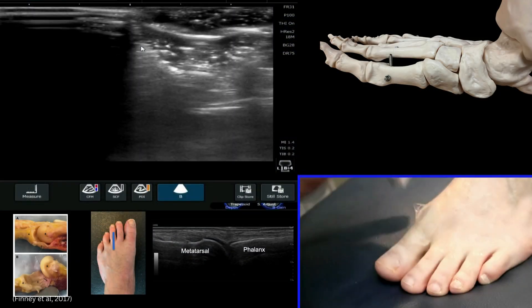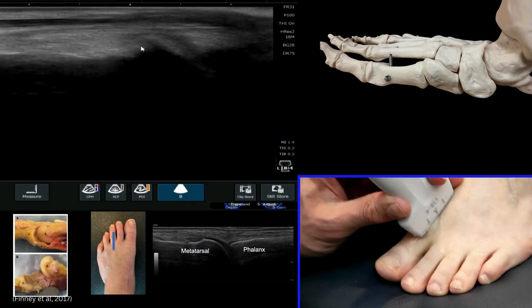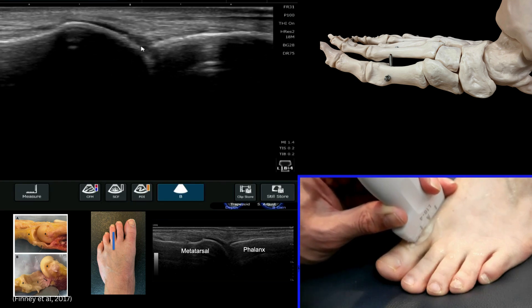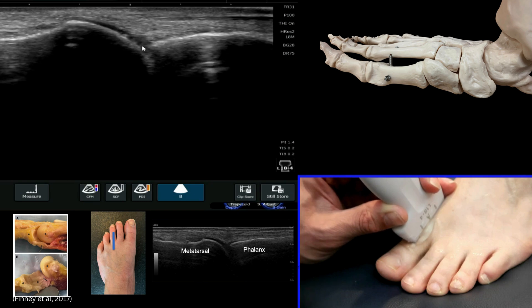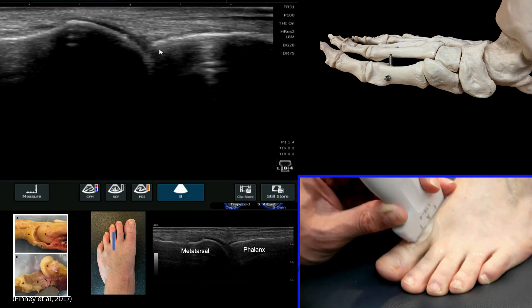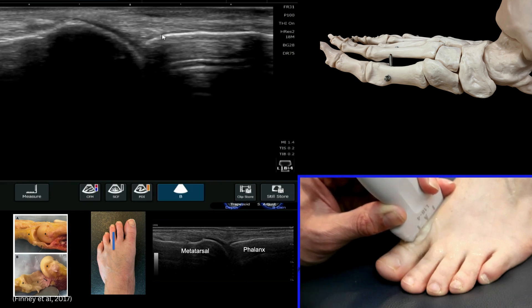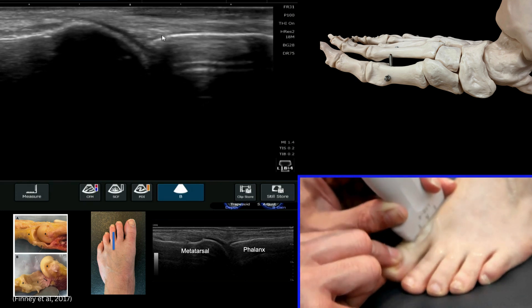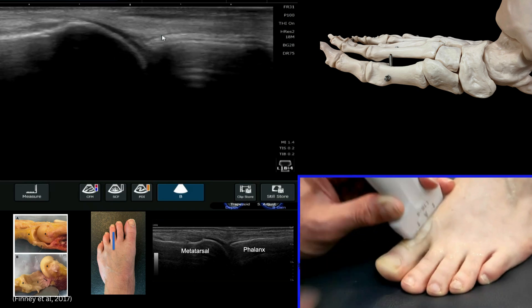We're now going to have a look at the dorsal recess of the metatarsophalangeal joints. If we look at the first to start with, we can see very clearly here the articular cartilage of the distal aspect of the metatarsal on the head, and then this is the proximal phalanx. We can move the toe joint to evaluate that joint more thoroughly.